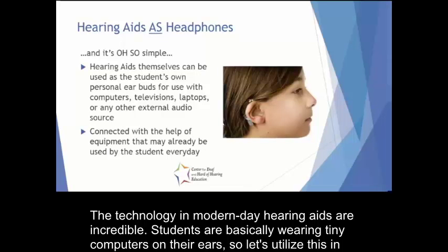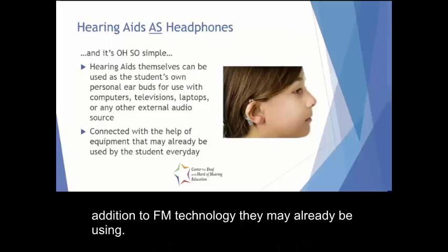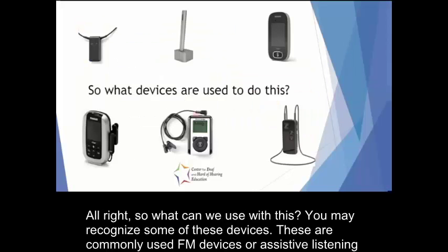The technology in modern-day hearing aids is incredible. Students are basically wearing tiny computers on their ears. So let's utilize this in addition to FM technology they may already be using. All right, so what can we use with this?